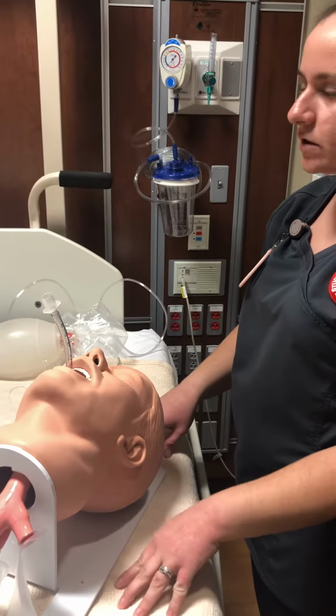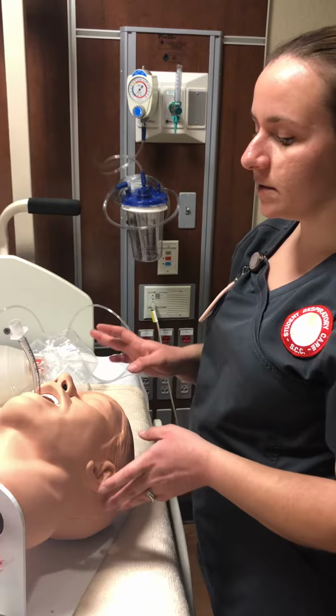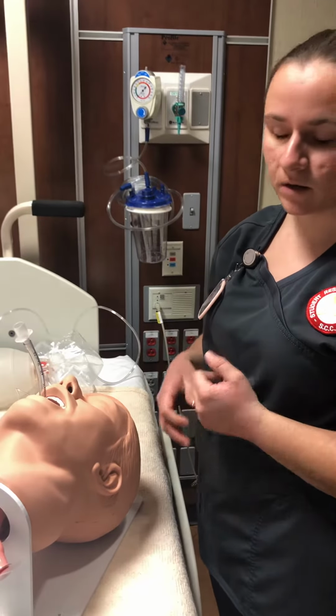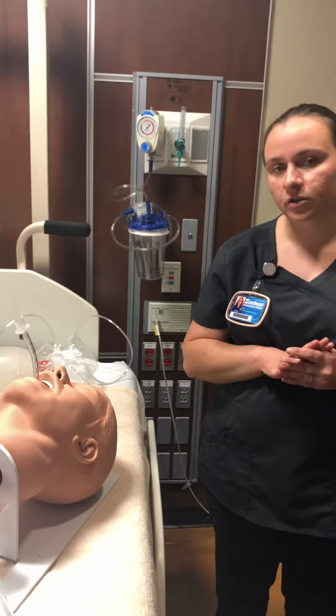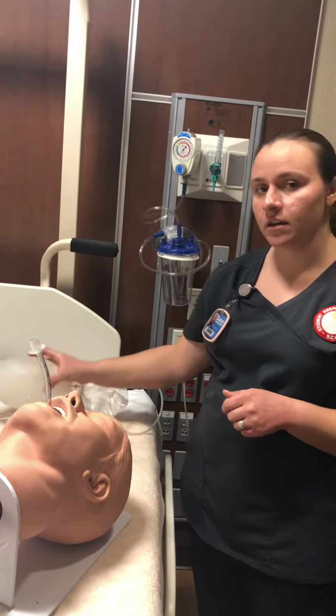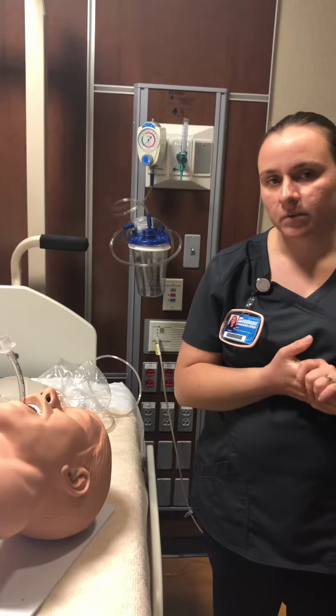I need to listen to the lungs to make sure they're getting the proper ventilation, and check the SpO2 to make sure that it is starting to go where it needs to be. Once I am done, I always need to chart in the patient's chart that I did a manual ventilation with an ambu bag. And once I am done, I always wash my hands before I leave the patient's room.